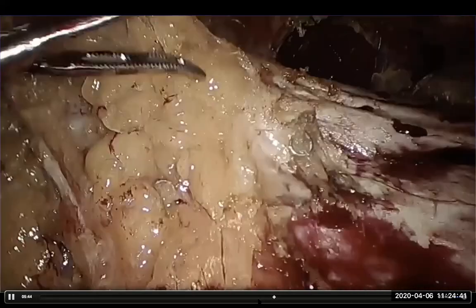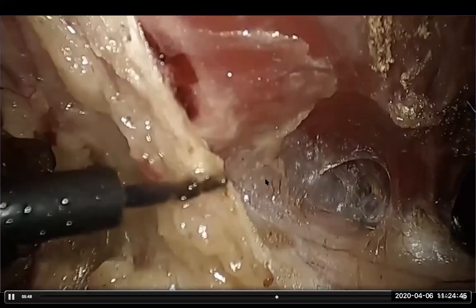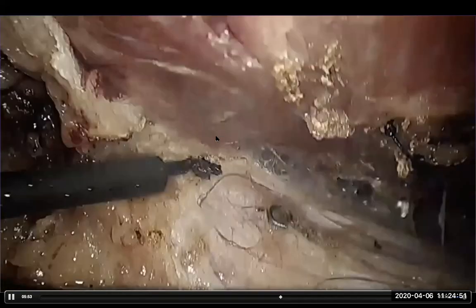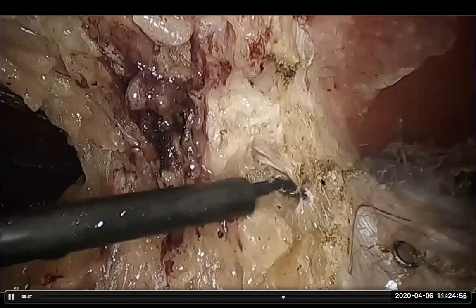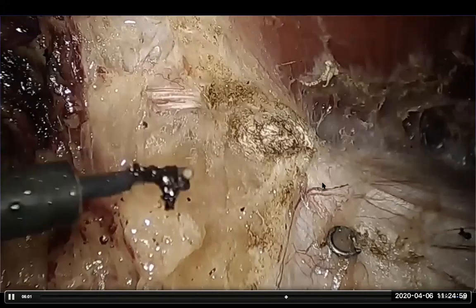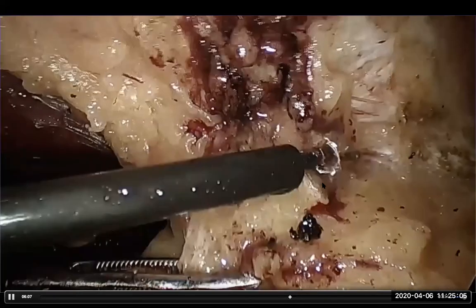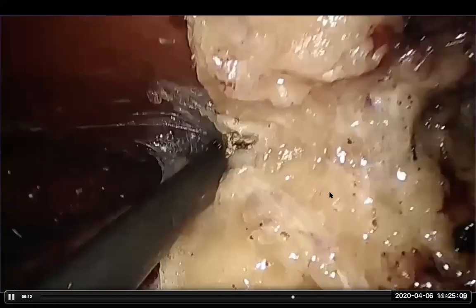Okay. So as you can see here, this is the posterior rectus sheath. The muscle always stays up, and what is a fascial structure medial to the muscle is the linea alba. You can see the tacks here. We keep pushing down the PRS with the IPOM mesh. So this is not a case where the IPOM mesh has got bowel adhesions or intestinal obstruction. So we are leaving the IPOM mesh intact here, okay?